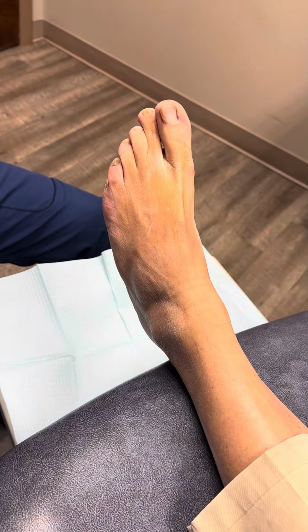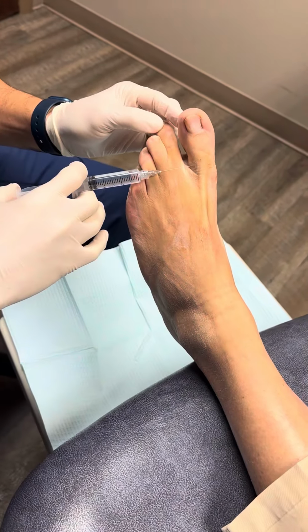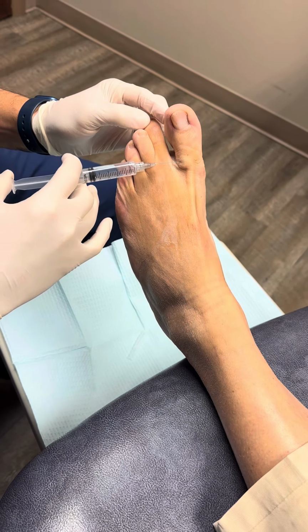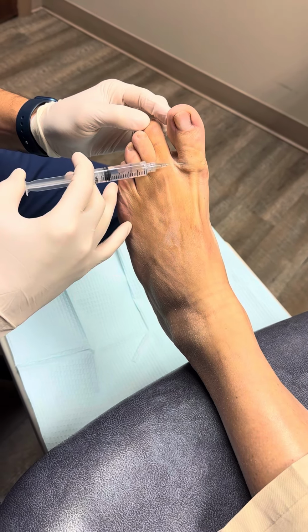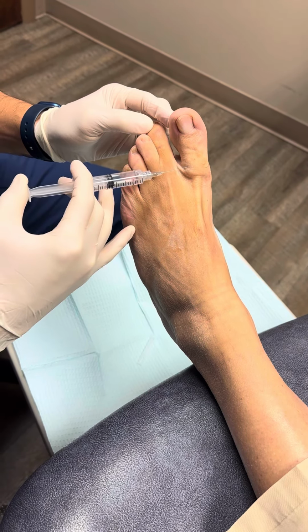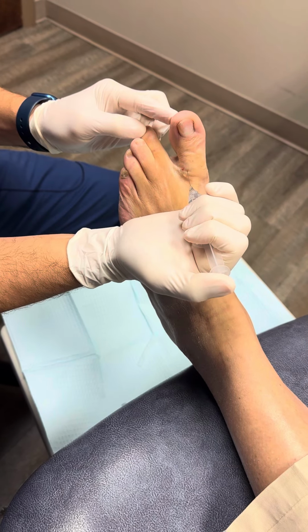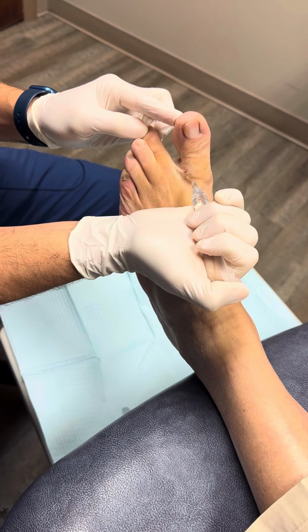All right. And we're going to hit him with a little pinch and burn. We're going to just hit the skin here, pinch and burn. We ask our patients to try and stay still. That's uncomfortable. A little pinching and burning. We try to go not too fast, not too slow. We don't want to jab or anything. And then we're going to redirect our needle down. So this is numbing the top of the toe. We're going to come from the side here, little pinch. And as we go down, we're going to give a little more pressure, okay, to the bottom of the toe.